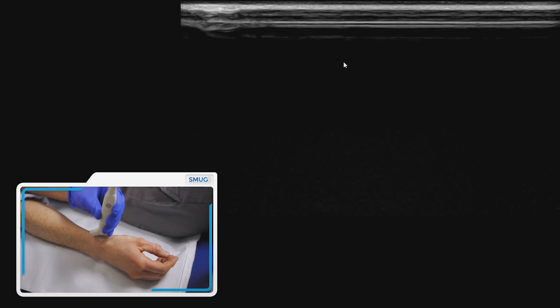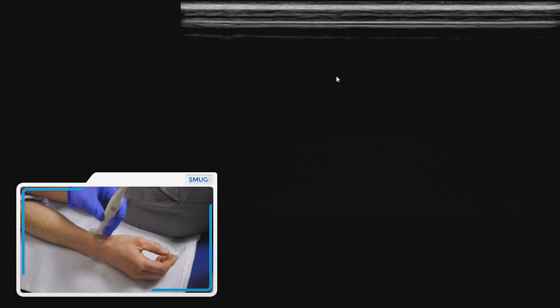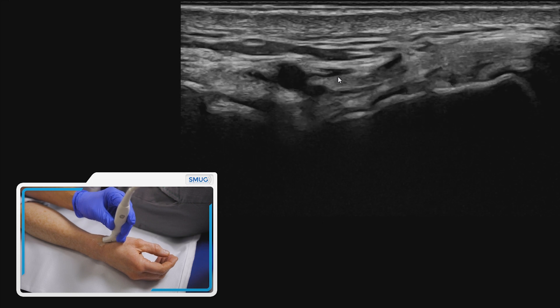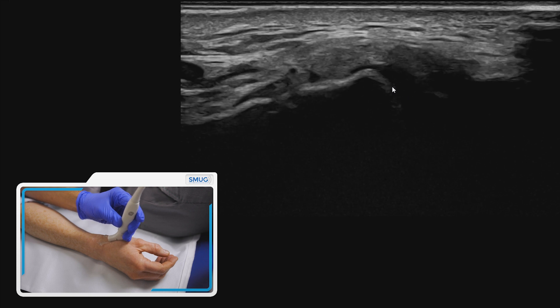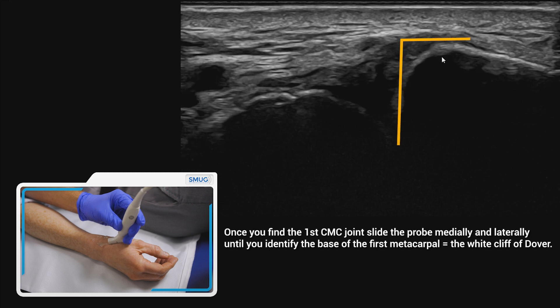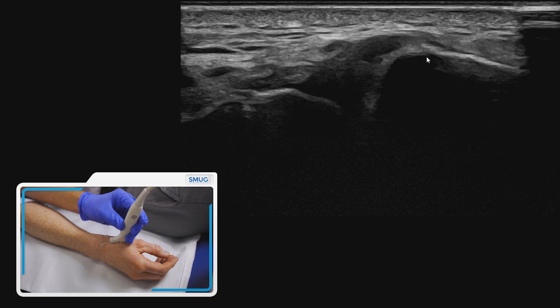So let me go through that once more. Find the end of the radius, slide down until you see the radial artery and the koala bear winking at you. Go a little bit further and you'll find the joint. Now we then need to find the white cliffs of Dover, which is the base of the first CMC. And if I just come around the back of the joint, that comes up — making a really nice target for our injection.